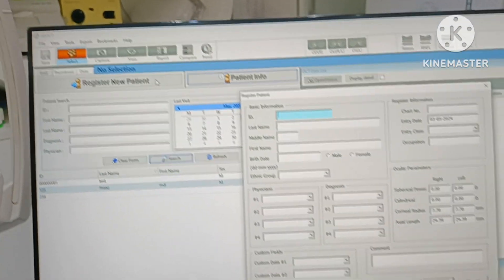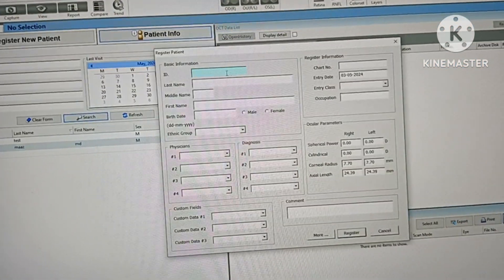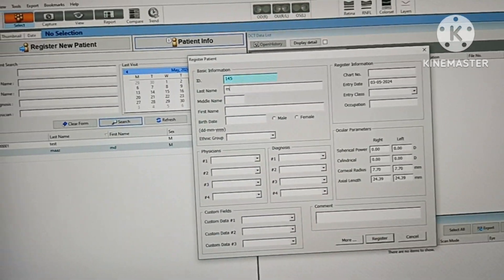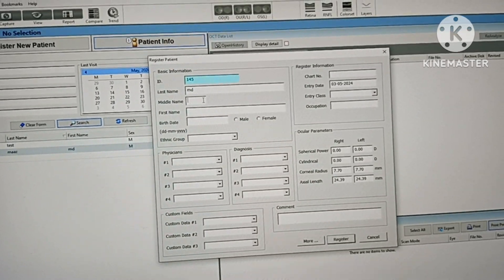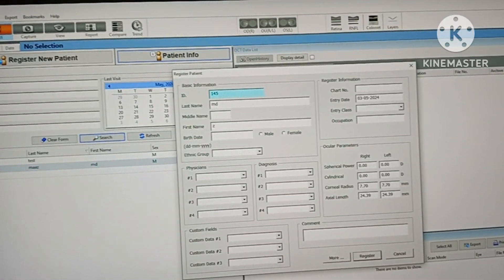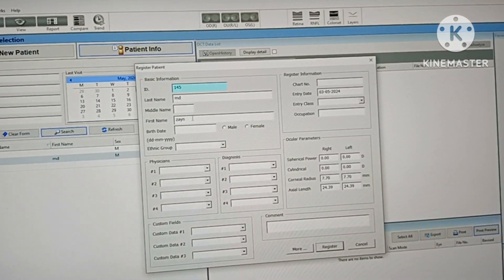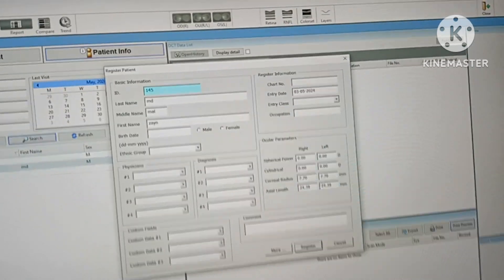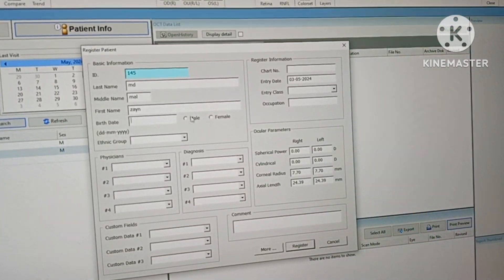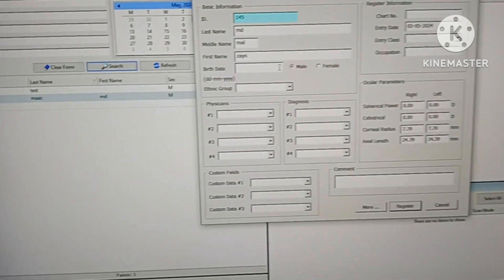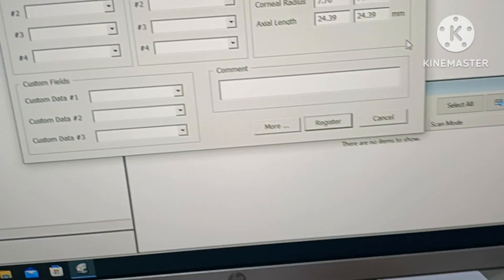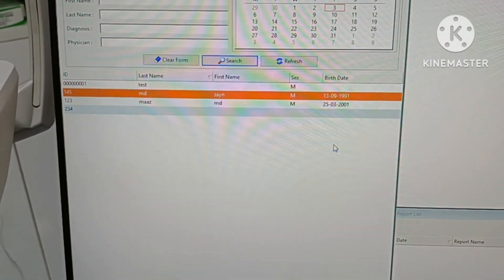I will fill the ID — I am filling 145. Last name: MD. Middle name: Zain. And Malik. Date of birth, male — fill date of birth. And now here I will register. Here is the new ID available: Zain Malik.